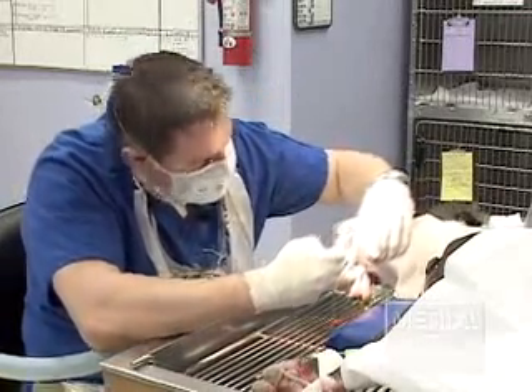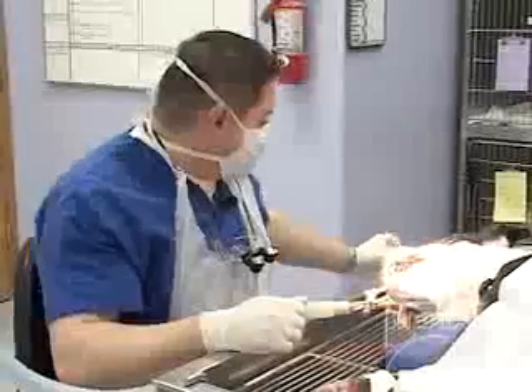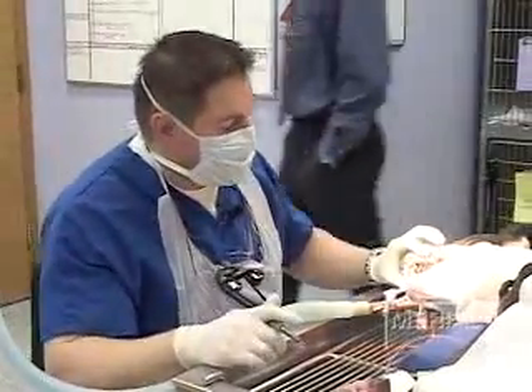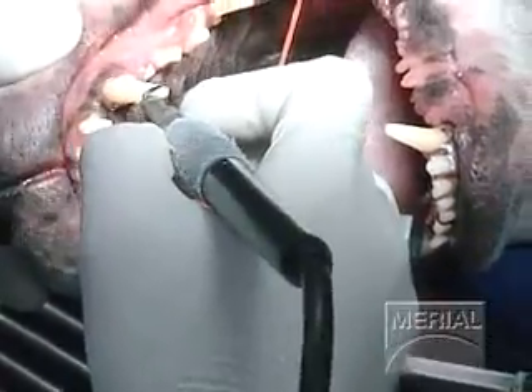We'll start cleaning these teeth up and evaluate more closely after the scaling is done. That brings us to the third step of the 12 steps of the professional cleaning, which we call supragingival cleaning — cleaning what we can actually see, which is the crown portion of the tooth.